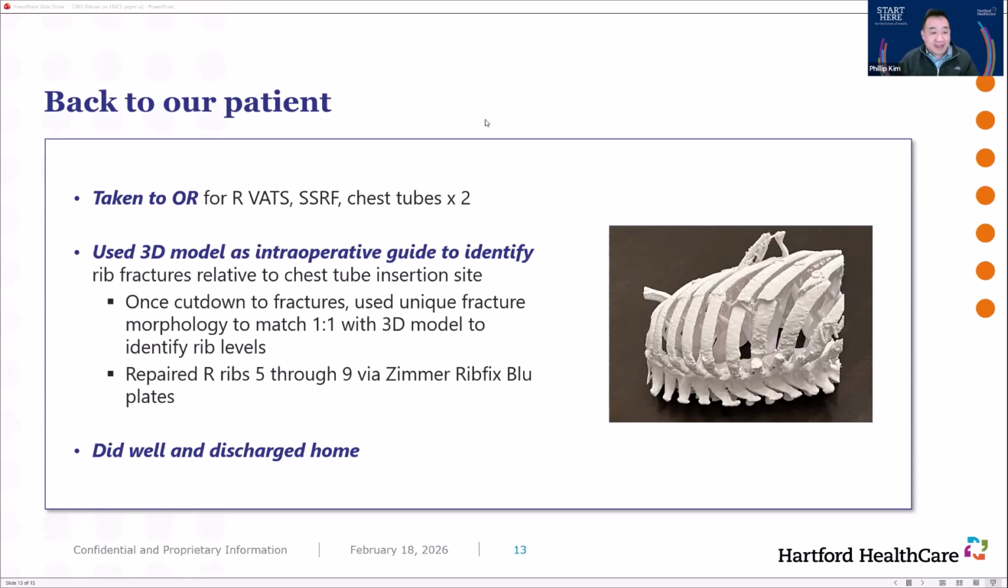So if you have a model in hand in the morning, you know, 7:20 in the morning with the surgeon and we're discussing our approach, then I think it really does help expedite that discussion instead of trying to explain things, versus just picking it up in your hand and being like, this one, let's do this, and keeping track of what our plan was.